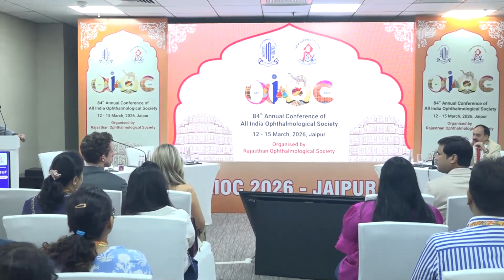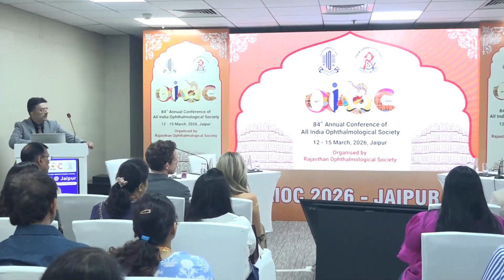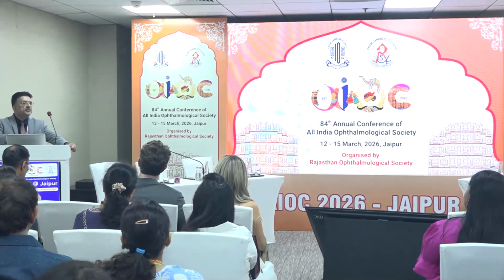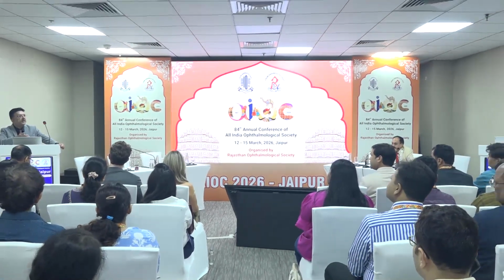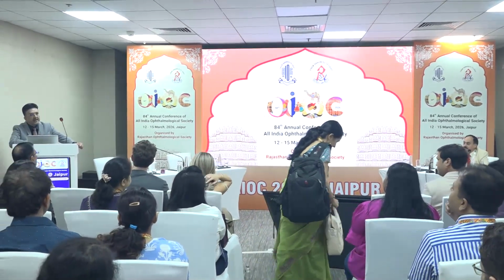I think Alcon goes up to -6, so it is only Rayner in the market which gives us hydrophobic IOLs up to -8 diopters. They are preloaded lenses, so we usually use them. In addition, I'd like to add, there's an Indian company, IOC, which can customize your lenses. Suppose you are operating a high myope where a toric lens is not available. You can send them the parameters, they'll design that lens and send it to you so that you can have a better refractive outcome.